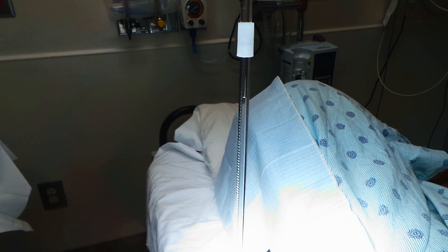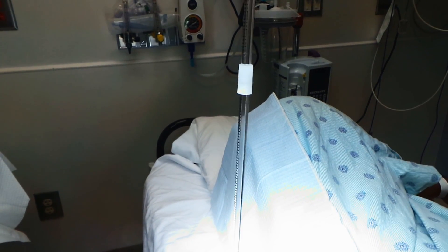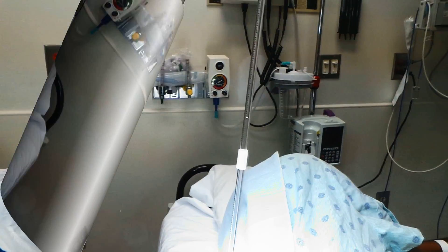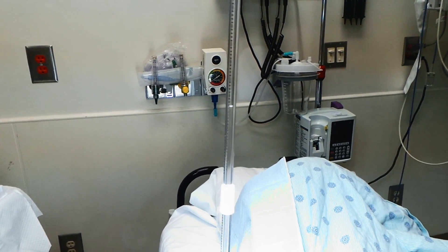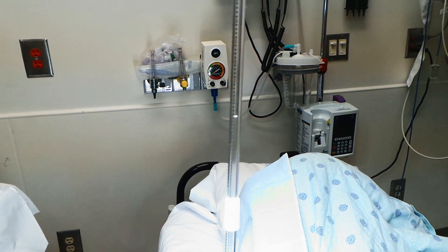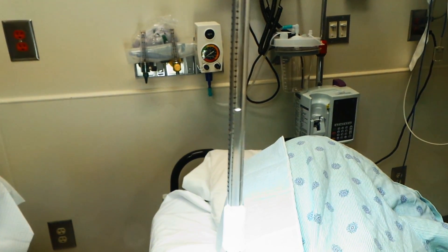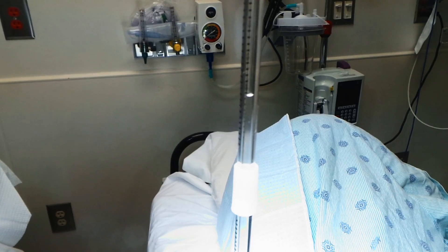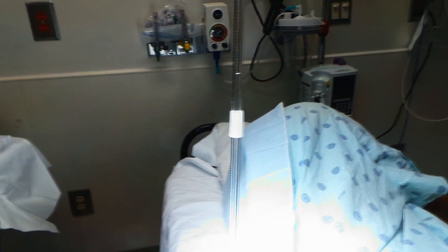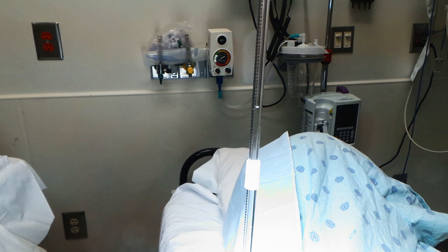The spinal tap pressure readings are coming in — 36, 42, 43. You have this leveled out right there. What's normal? We're talking about 20 or less. So it's hanging in there around 41, going back up to 42. This definitely is diagnostic — the pressure is well above the normal threshold of 20, confirming elevated intracranial pressure consistent with idiopathic intracranial hypertension.